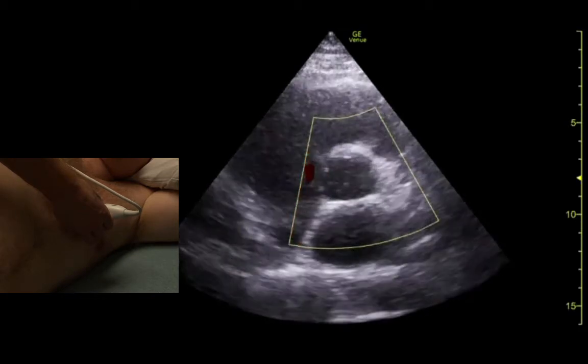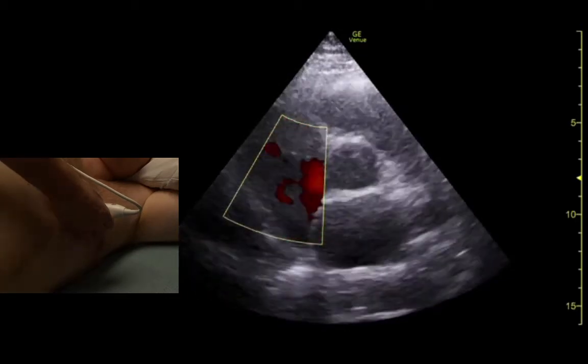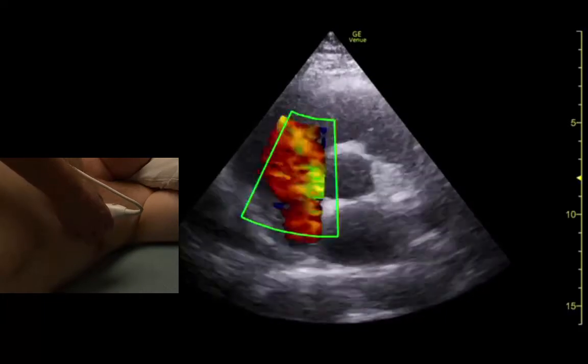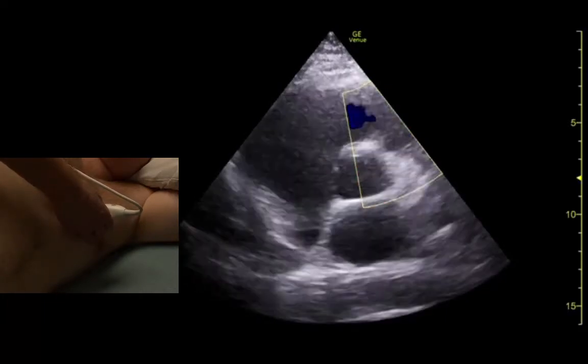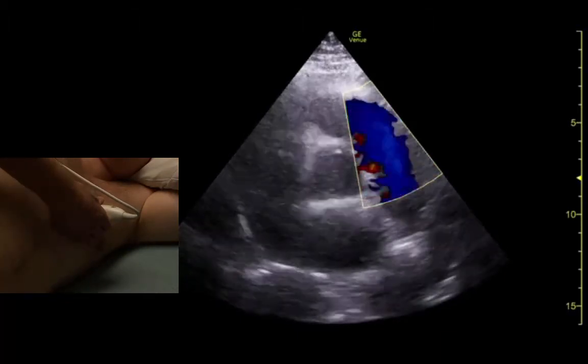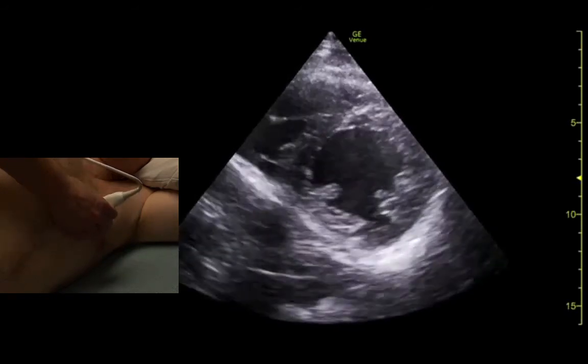Let's just put color on those. It should all be red coming towards our transducer, and it should all be blue over here. There it is — it should all be pink. Here we go.